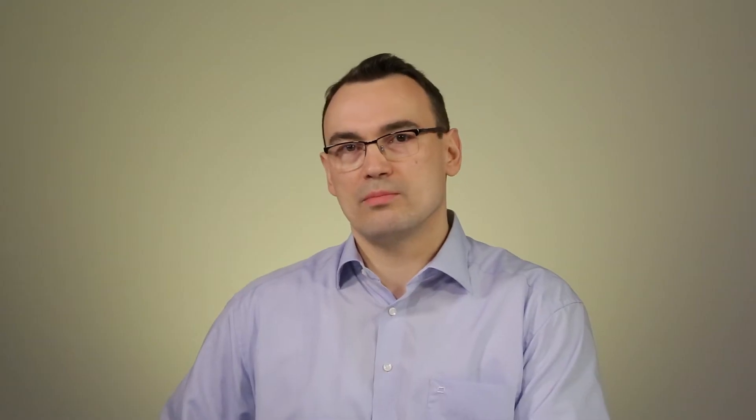The two-channel full ring applicator is mainly chosen due to its fixed geometry. It allows for quick insertion into the patient and allows for easy reconstruction in the treatment planning system.